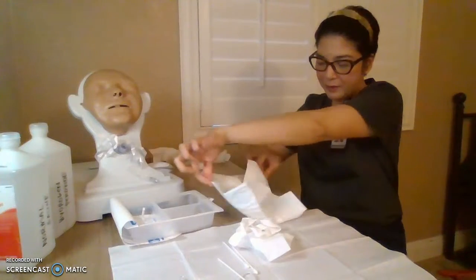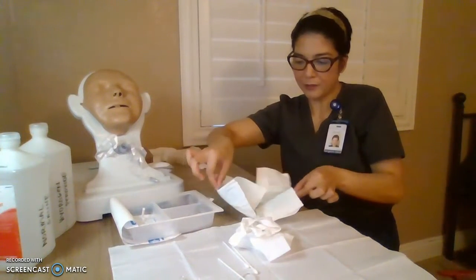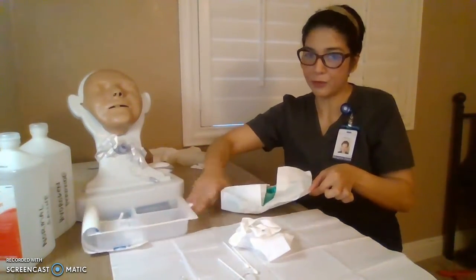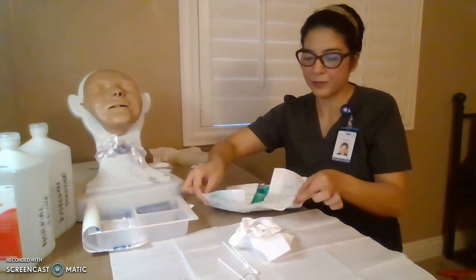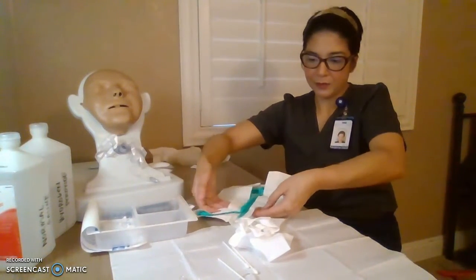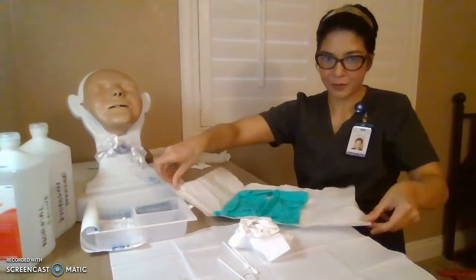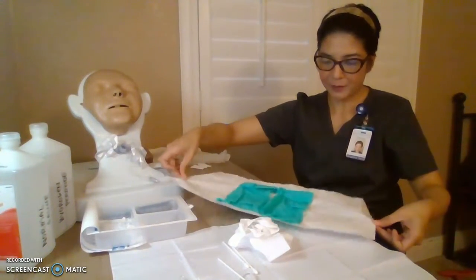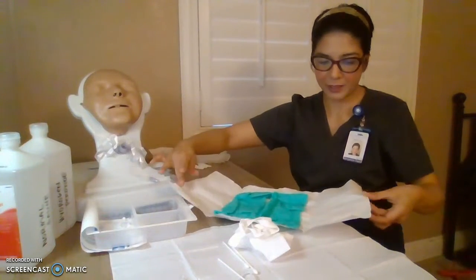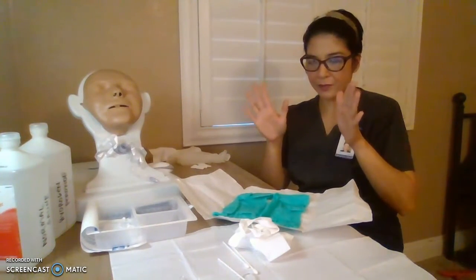Mind your sterile field still. Do not hover around that area. Move this over just for the purpose of the video. Okay. Do not touch the inside. Pull out. Okay. Pull out. Do not touch anything else over that area. So nothing is sterile as of the moment.